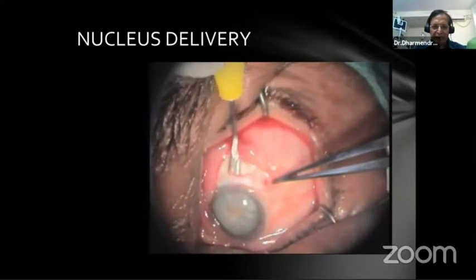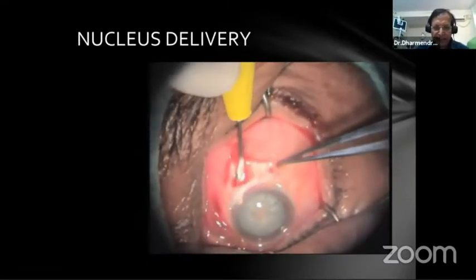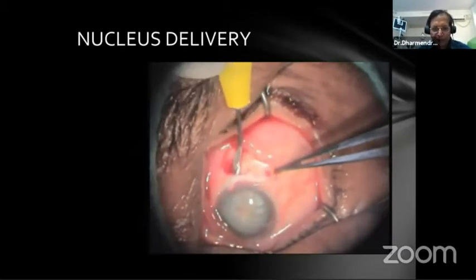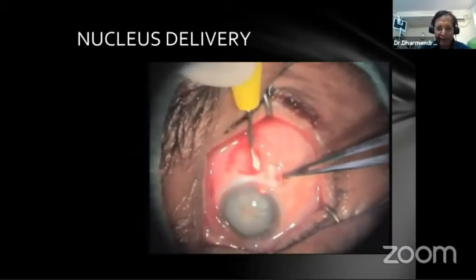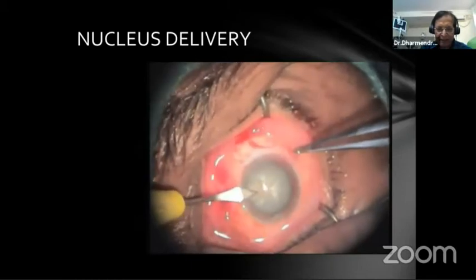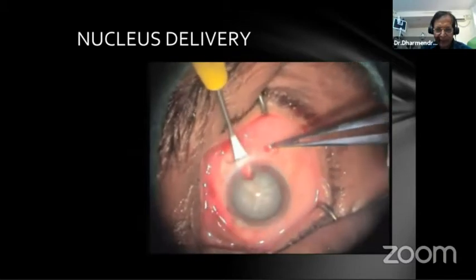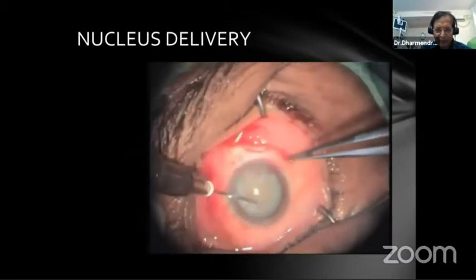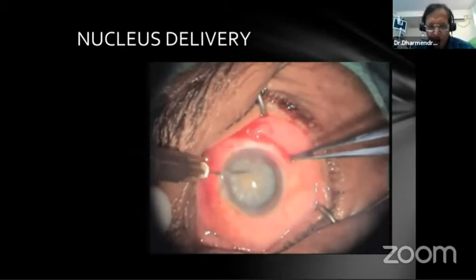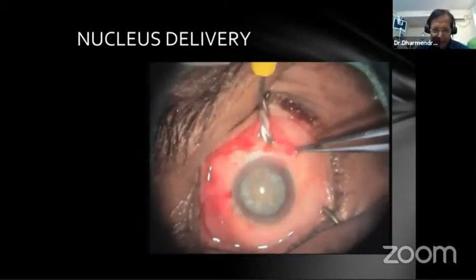And here we are giving the frown incision, side pockets are made, and sufficiently we go into the cornea. Side incision is given just to do the irrigation aspiration. The anterior chamber is entered, and capsulorhexis is done, of course. And the side pockets and the side incision are given.